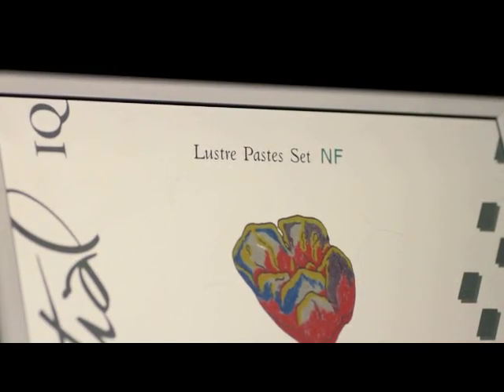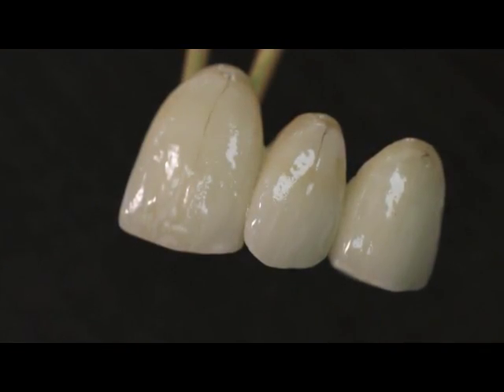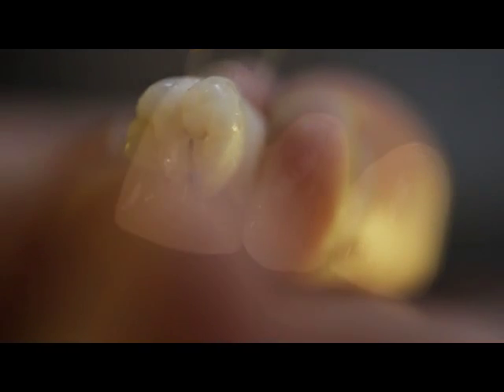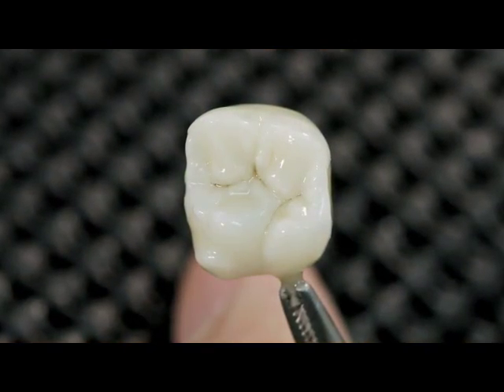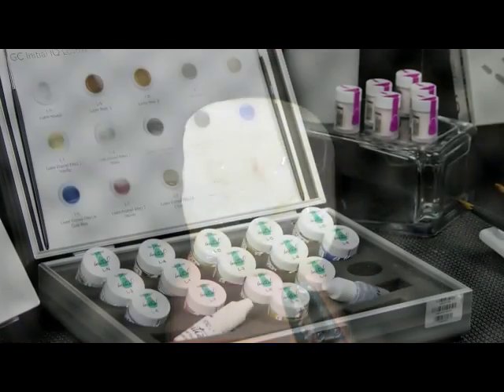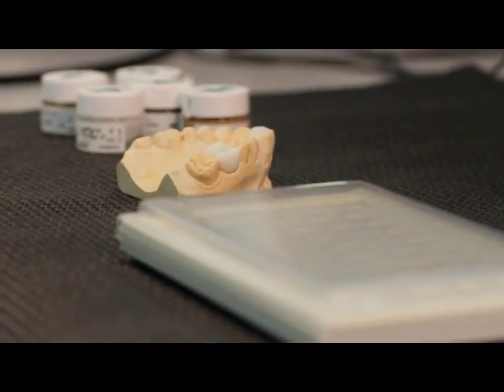GC Initial IQ Lustre Paste NF are three-dimensional ceramic pastes developed to bring color depth and lifelike translucency for the complete GC Initial ceramic range. Thanks to their new formula, you can now really bring your crowns and bridges to life with this dedicated Lustre Paste NF set, with an optimal match to both low and high CTE ceramics.